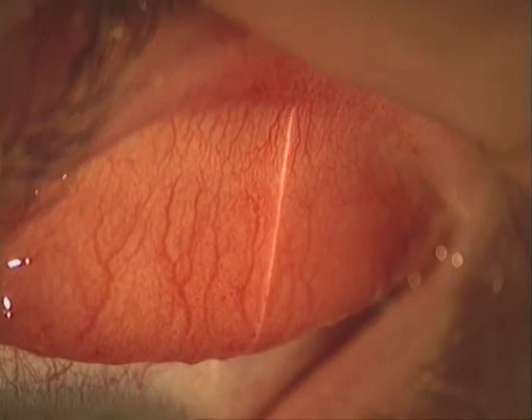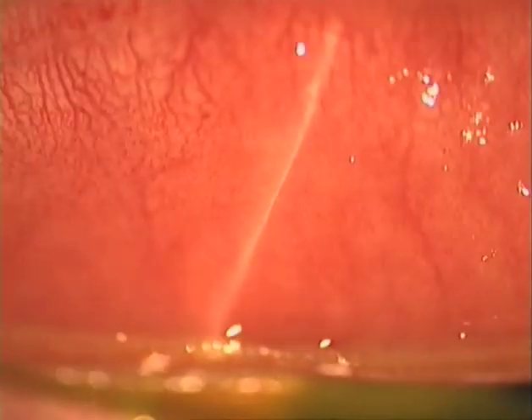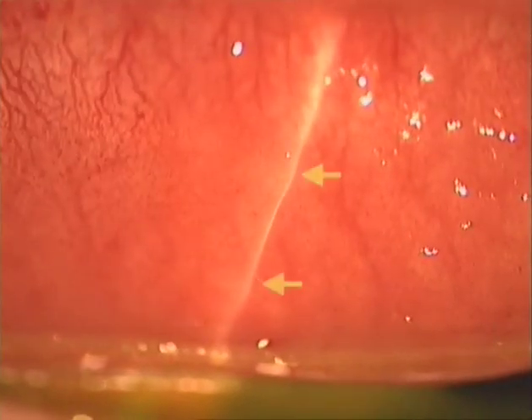Compare this with the vascular pattern of the tarsus in the other eye of the same patient. The whitish focal areas are only slightly prominent, as seen in optical section, and the deep lymphocytic infiltration has formed only these flat elevations, but no really prominent follicles have occurred in the conjunctiva fixed to the tarsus.